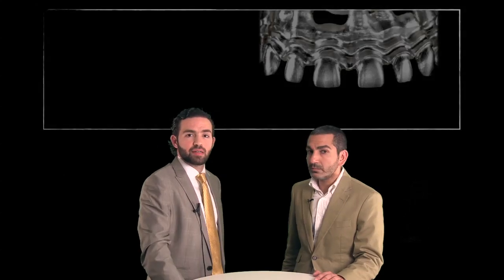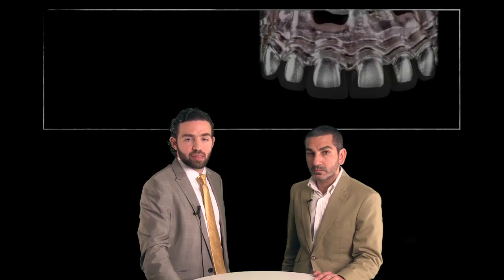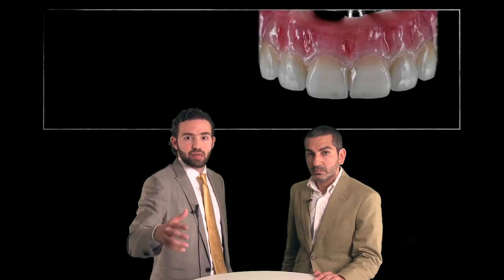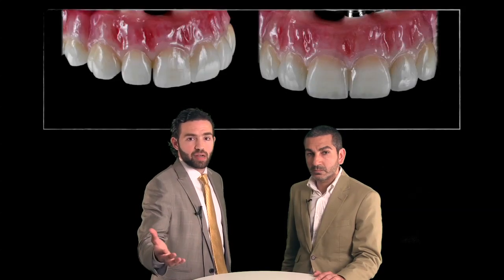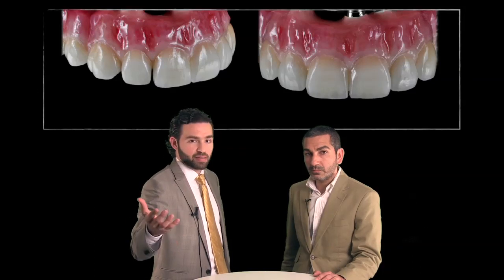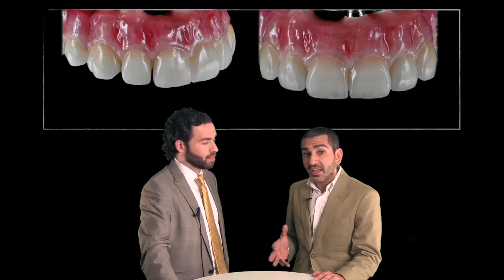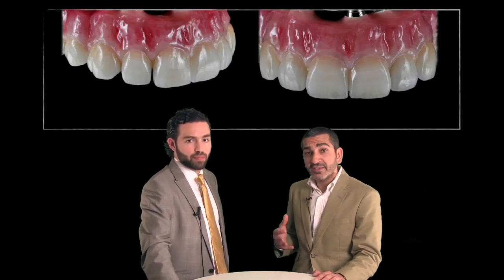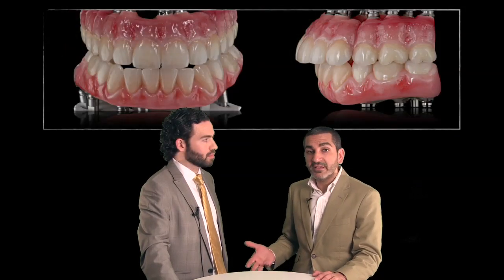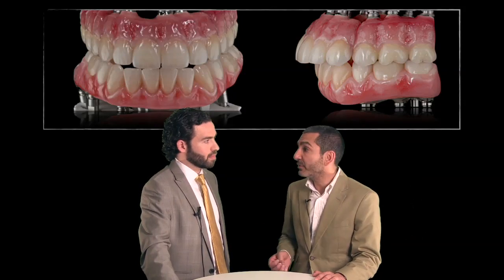Just have a look at this clinical case. It is a full mouth, comprehensive, complex case done with porcelain fused to metal. And you can see here the outcome looks very nice. I wonder, can you tell if this is zirconia or metal as a substructure? Not at all. Simply, again, because the technician has adequate reduction, understands the material, has proper knowledge, and has the skills to be able to deliver this effectively. It's as simple as that.